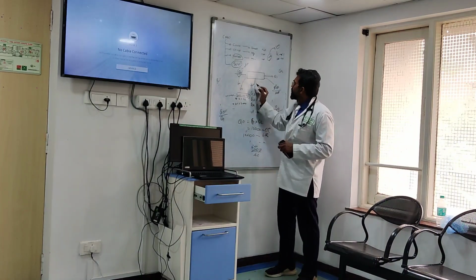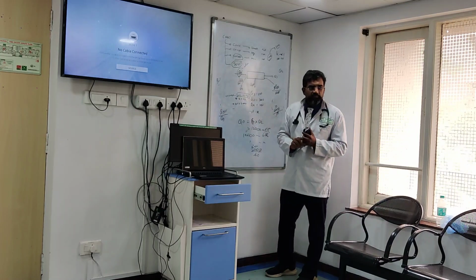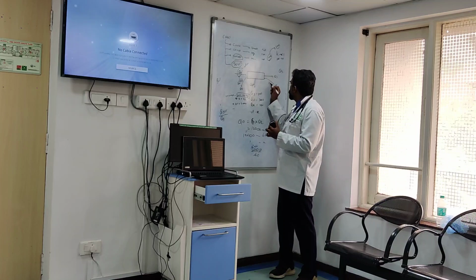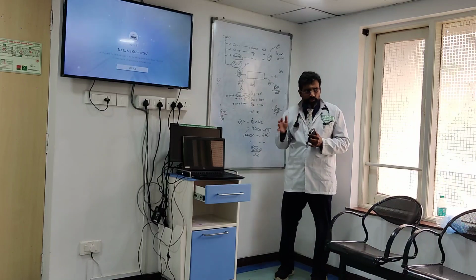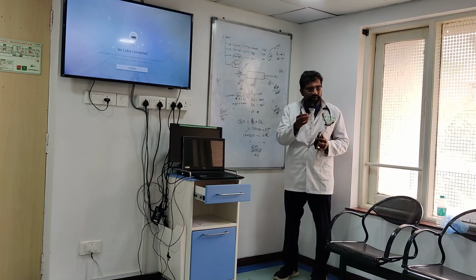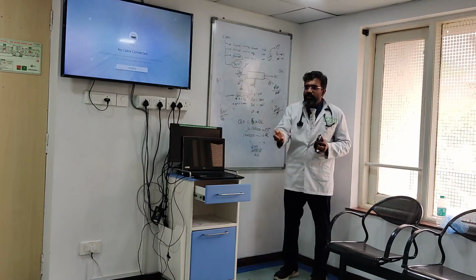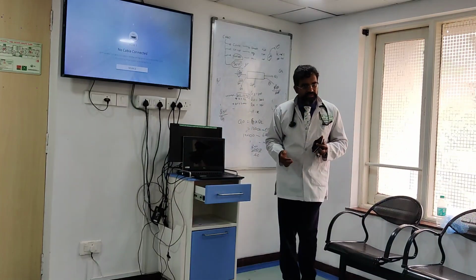That is why my replacement fluid will initially have maybe 0K. Keep 0 potassium on the replacement fluid because I want the convection to occur. My dialysate will also be 0K. I'm going to do that, but I'm going to quickly follow that up because it is very dangerous to keep 0K, because अगर जल्दी हो गया तो पेशेंट को पोटेशियम 1, 1.5 हो जाएगा, patient can arrest. You understand? So I'll probably do 0K, but 2 hours later I will check क्या पोटेशियम आ रहा है to see what is the trend. समझ में आ रहा है?